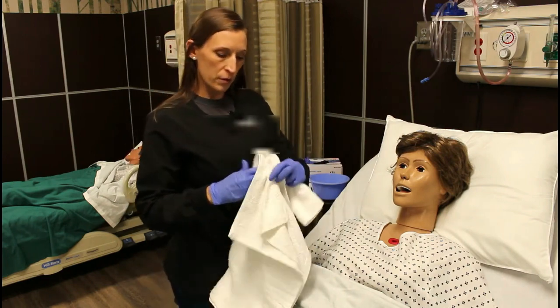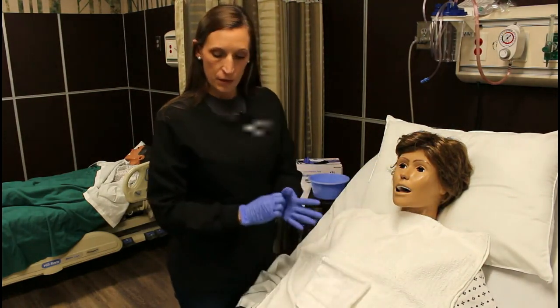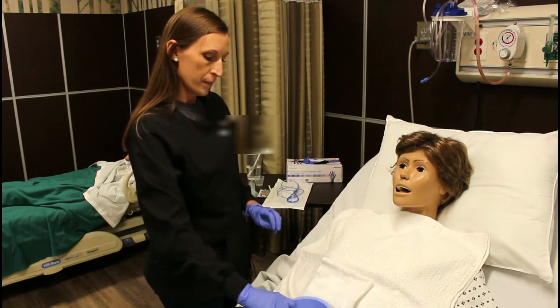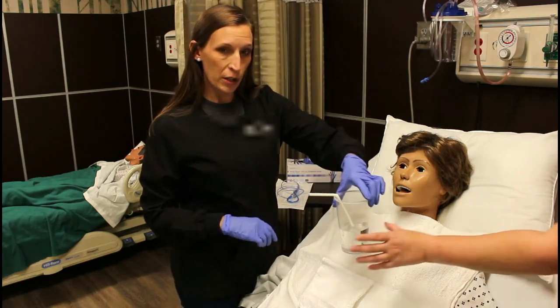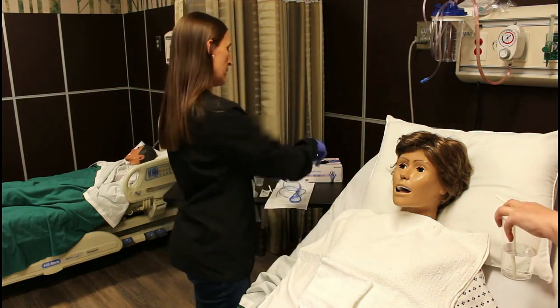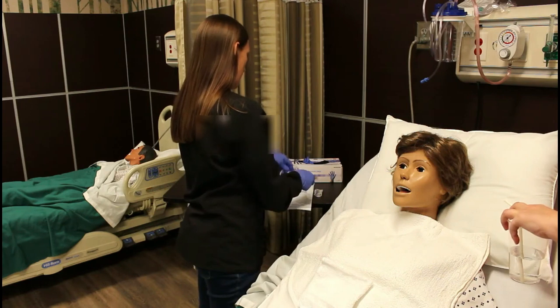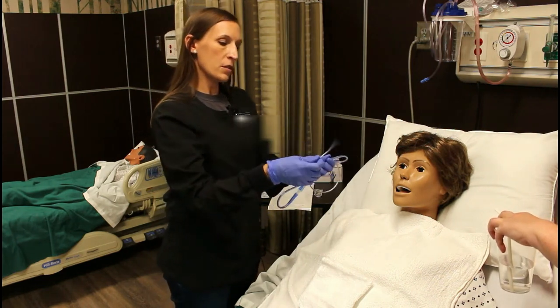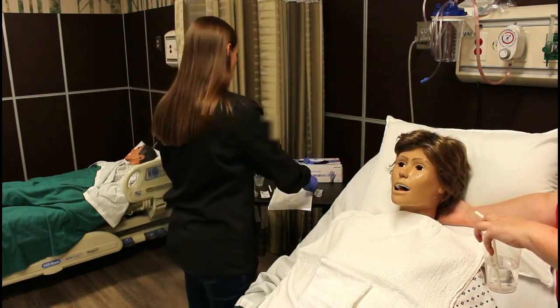You want to prepare the patient with a towel, a washcloth, and an emesis basin. You'll also have your cup of water ready with a bendy straw — the patient would generally hold this, but I'll have my assistant hold it for me. Take your lube and squirt it on your paper. You're going to curl the tube up in your hand so it doesn't dangle. You're going to insert the tube at an angle like this — not this way, but this way. So I'm going to lubricate the tube.